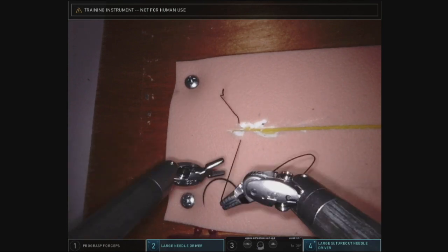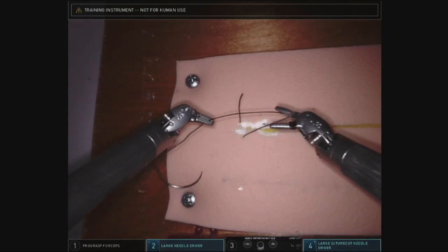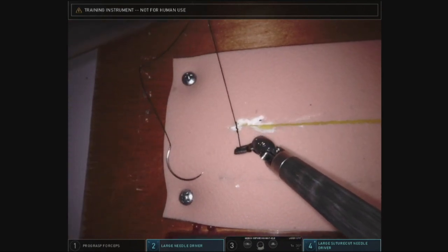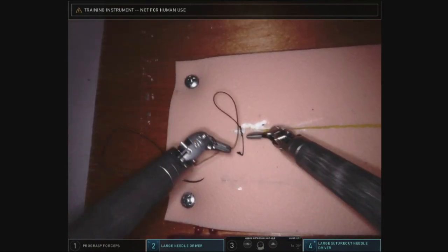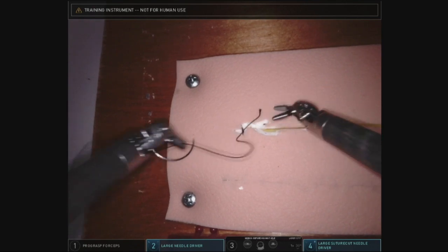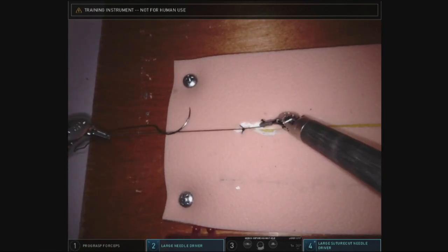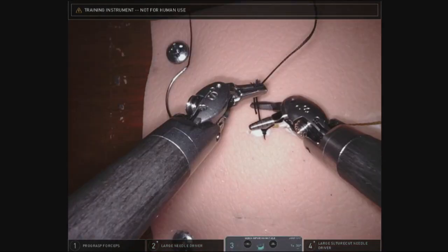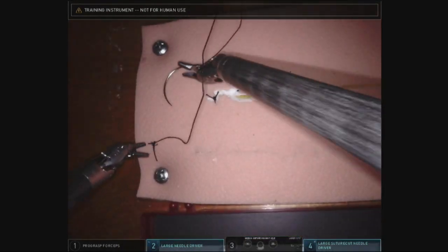When you tie the knots, the first knot is always a surgeon's knot, followed by 2 or 3 other knots to secure it. It's always easier to keep the tail short when you're doing knot tying with the robot. You can cut the sutures by using the suture cut needle driver, which has a scissors on the inside of it.